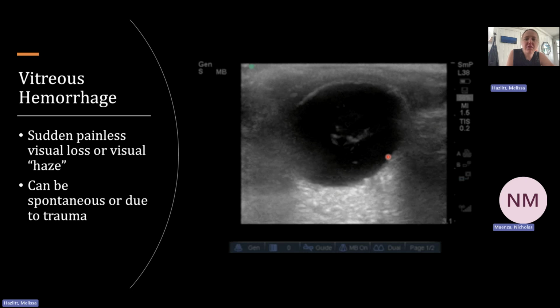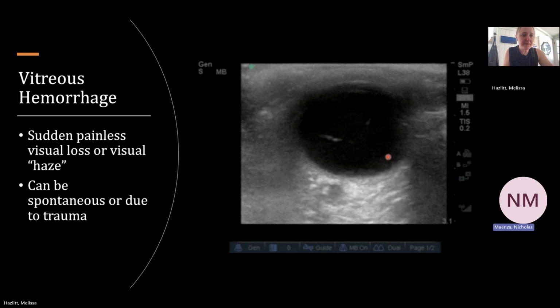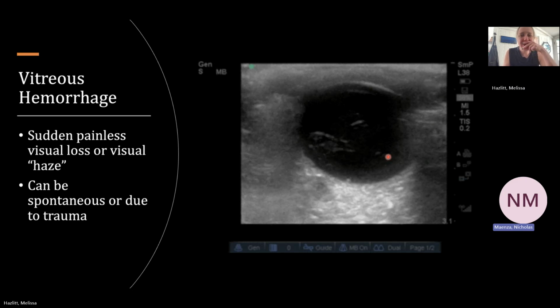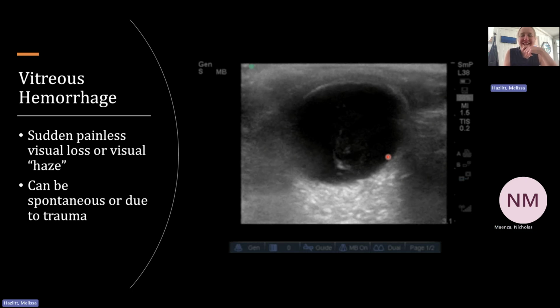Like forever, it doesn't really even move. I'll keep it as well, since it's being recorded, just say you signed this patient out to me and showed me the images. Oh yeah. And I went back, by the way, and tagged it on Butterfly. So it's tagged as vitreous hemorrhage on Butterfly. Good. Yeah, and I favorited it too because I was going to add it to this.